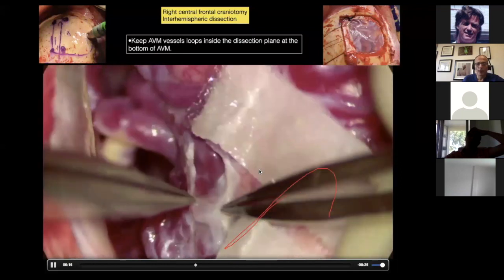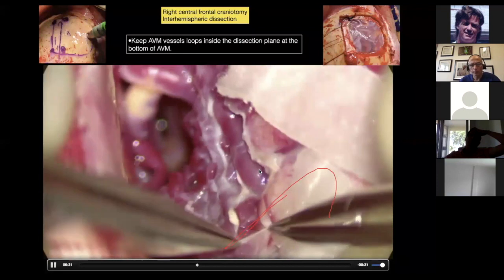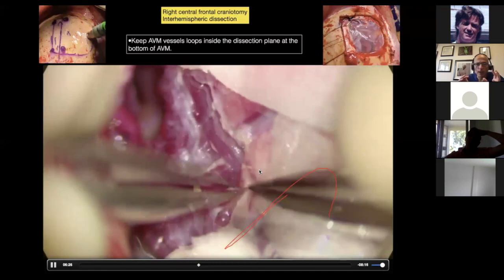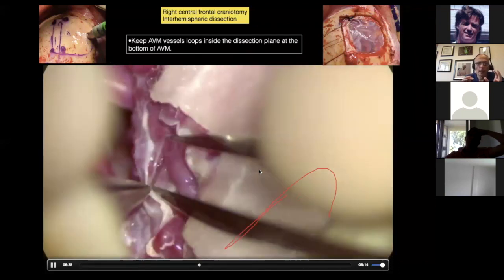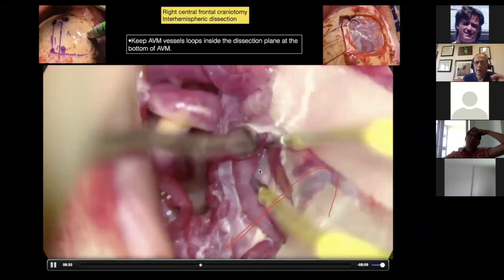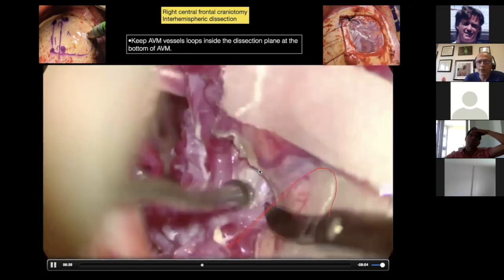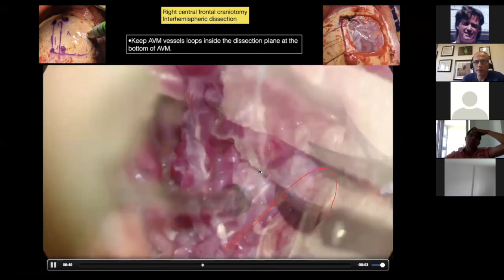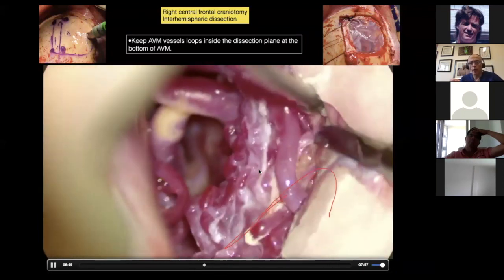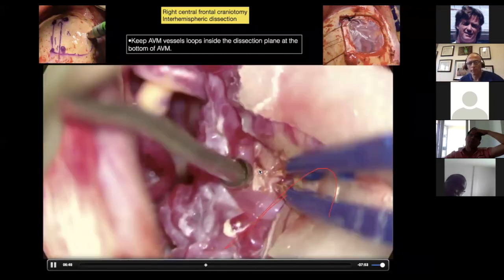So this is another thing. I'm applying the Yaşargil peeling technique. Because I don't know why, but sometimes I feel like cutting sharply may cause injury, and then I do peeling, and sometimes I do spreading, and this comes with time. I cannot explain to you when I feel I need to cut, when I feel I need to do peeling or spreading. So now I'm skeletonizing the AVM one by one, patiently, okay?